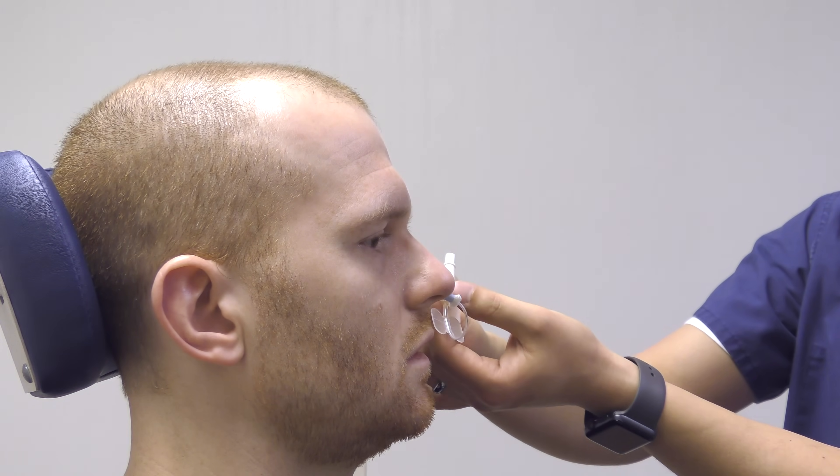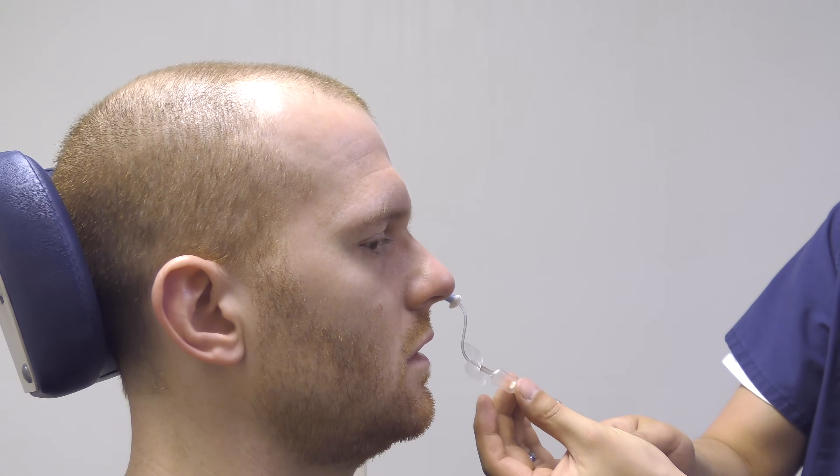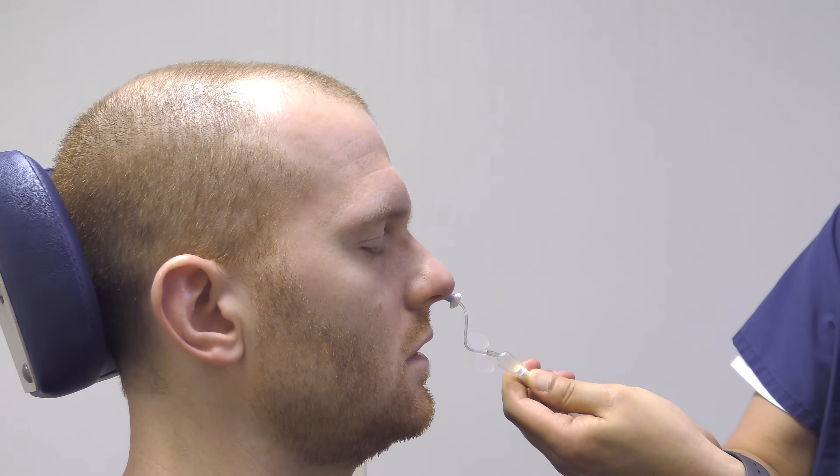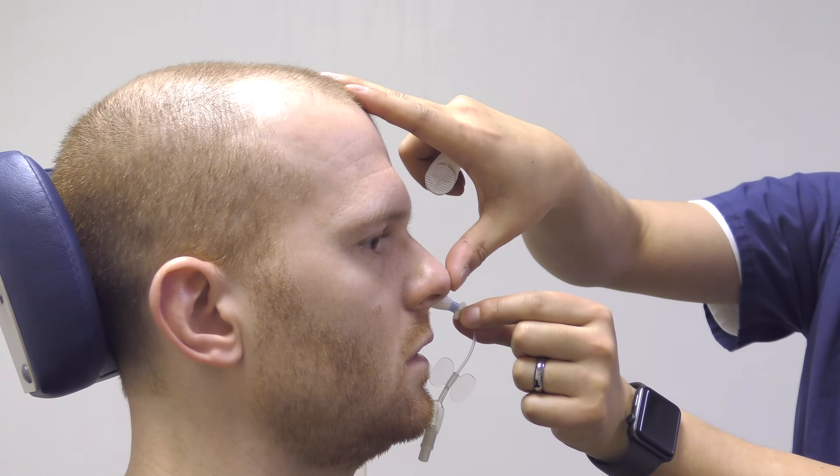Once the nasal packing is ready to be removed, the nasal packing balloon is first deflated by removing all the air. The nasal pack is then removed.